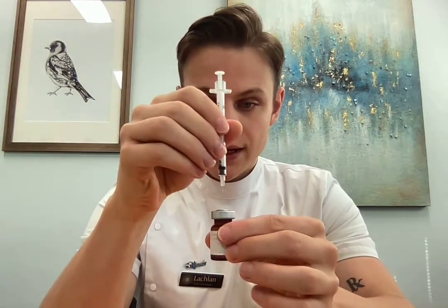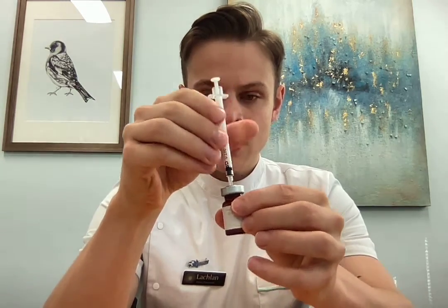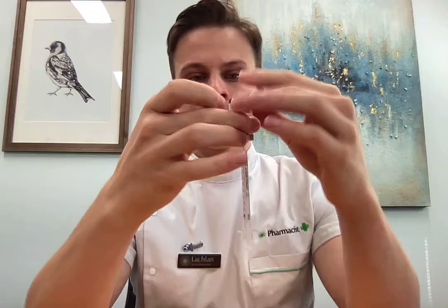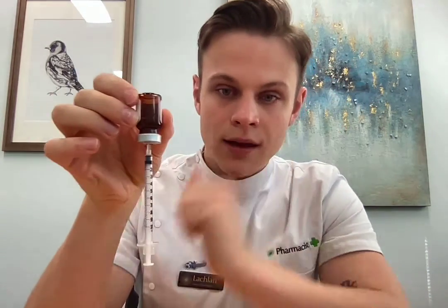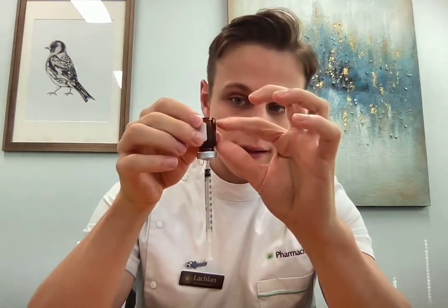Once your bung has dried, hold it straight, put the needle on top and push straight in. Then invert it. Now you need to make sure that the needle head, which you can see in there, is beneath the level of the liquid. This is quite easy when you first get the medication as it's going to be quite full, but on subsequent uses you may just need to pull it down a little bit to make sure that you don't draw up just air and no drug.